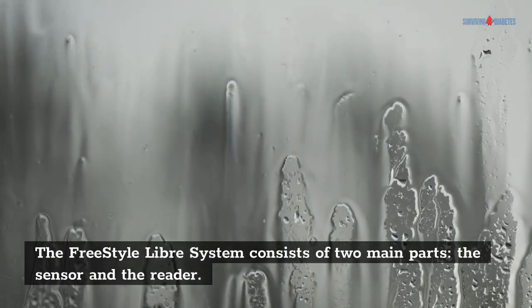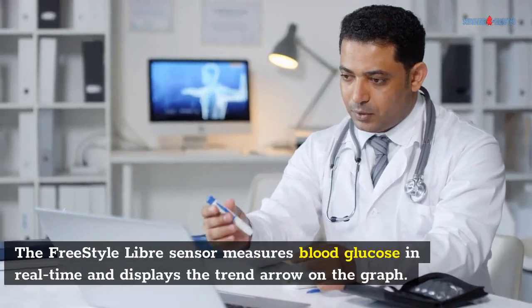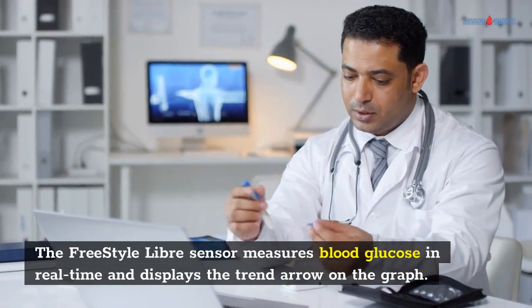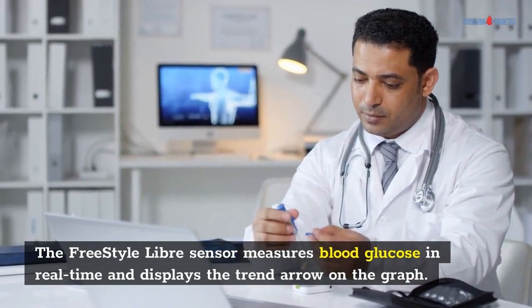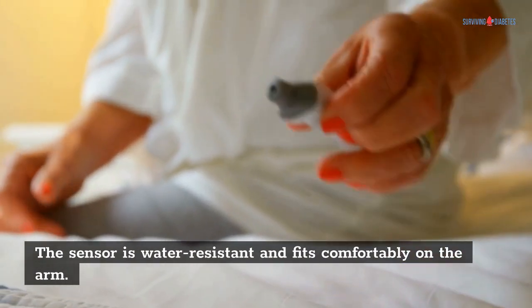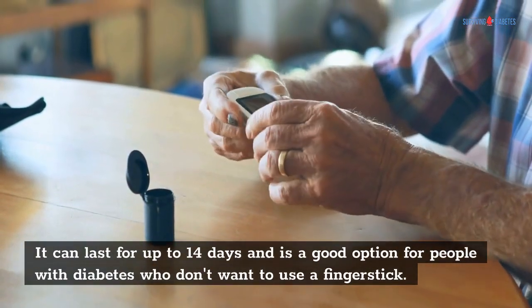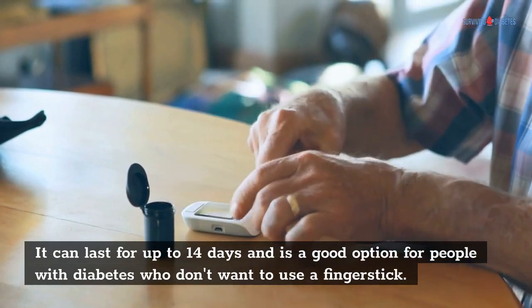The Freestyle Libre system consists of two main parts: the sensor and the reader. The sensor measures blood glucose in real-time and displays the trend arrow on the graph. The sensor is water-resistant and fits comfortably on the arm. It can last for up to 14 days and is a good option for people with diabetes who don't want to use a finger stick.